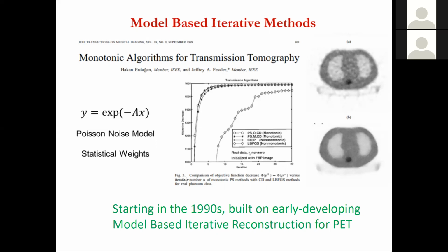then you see the analytic approach would be saying, okay, what would the ideal data look like? Whereas the model-based approach ideally wants to say, okay, given everything I know about the system, I should expect there to be a hole in the data over there, or I would expect the data to be softened, or it becomes like a calibration throughout the whole system. So that's your model-based approach.